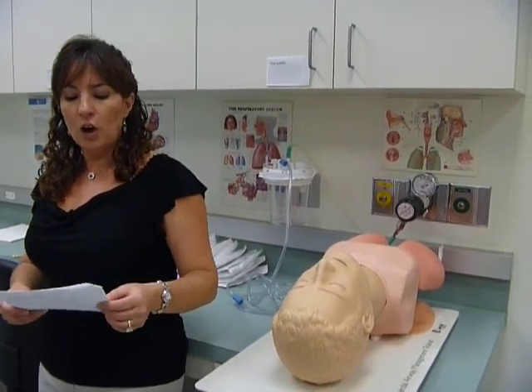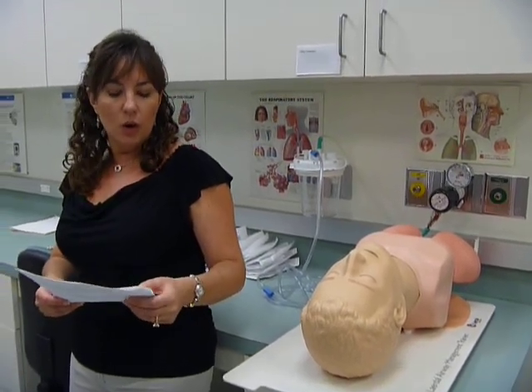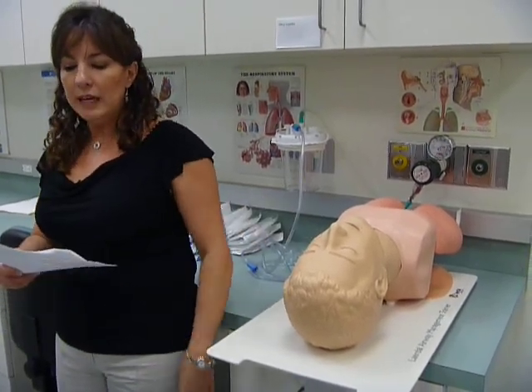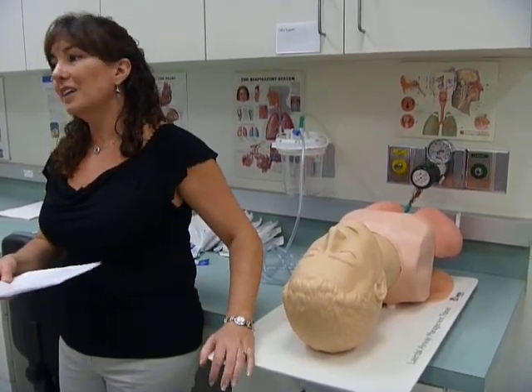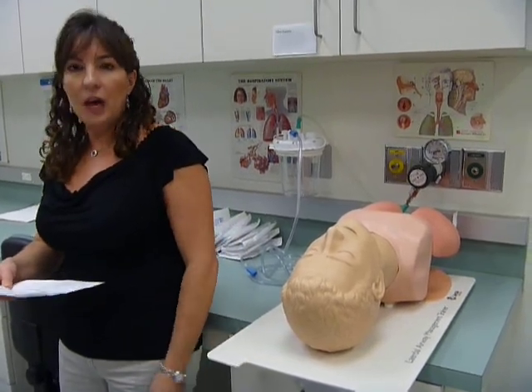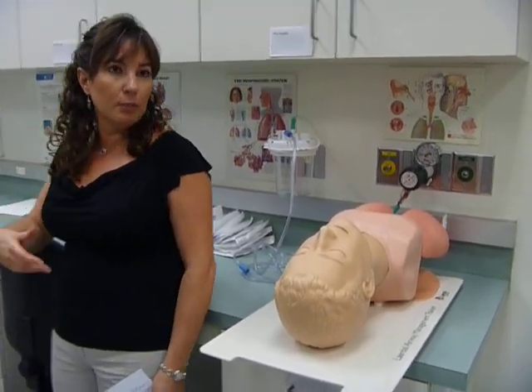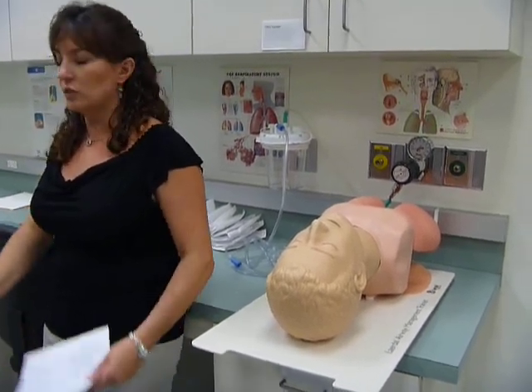So number 2, what are the complications associated with an invasive procedure such as suctioning? Well, remember, the lungs are sterile, so because we're introducing this catheter into the patient, we can also introduce bacteria into the patient. So we're contaminating the lungs. Patients can end up with pneumonias and things like that because of it. Also, when we suction out, we're suctioning out some of the air in the lungs, so the patient may have hypoxemia. So their oxygen saturation may drop while we're suctioning out.